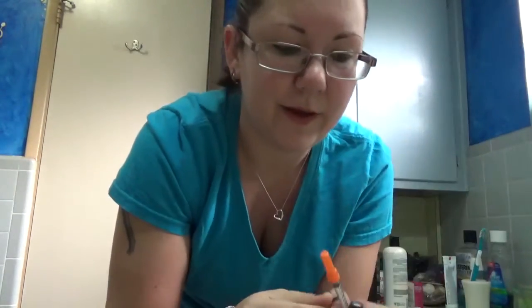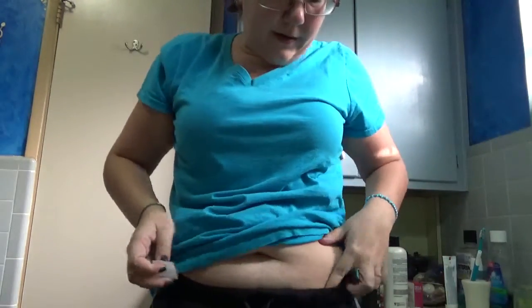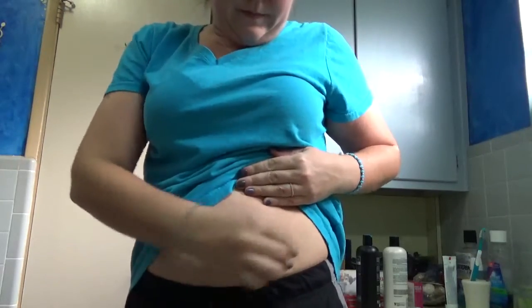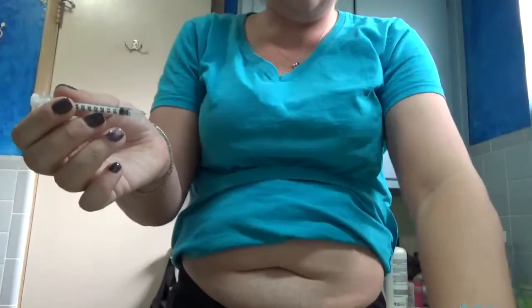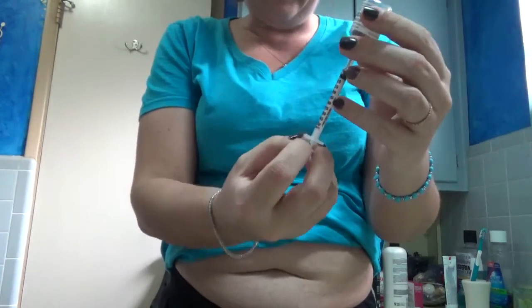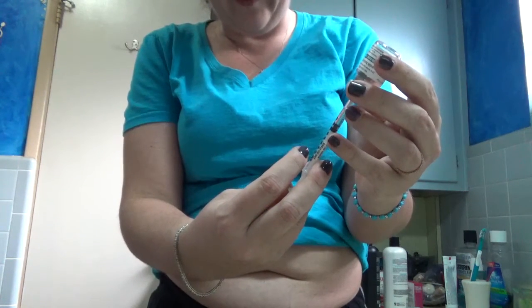I'm not going to uncap it yet until I'm ready. I open up the other swab and find an area to inject — today it's going to be the left side. I clean the area so it's nice and clean. Then I uncap the syringe, get the Lupron, stick the needle in, turn it over, and draw in 10 units. What I do is draw in a little more and then push the excess out — that way I don't have to fight bubbles or anything.